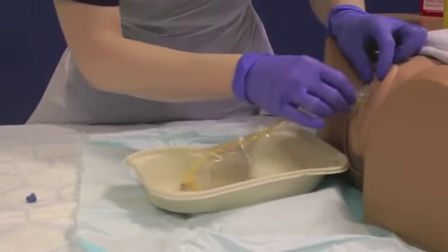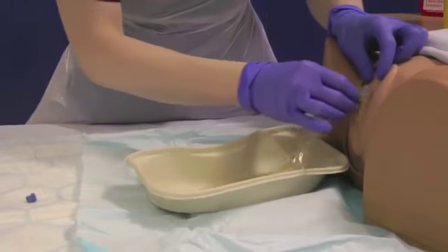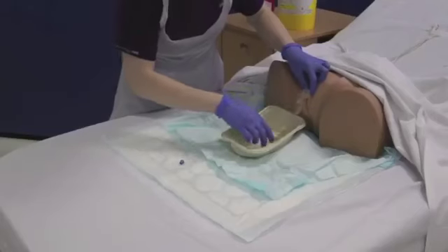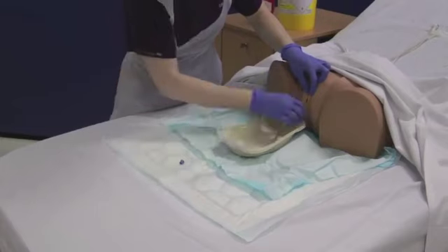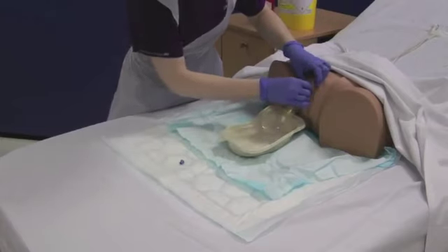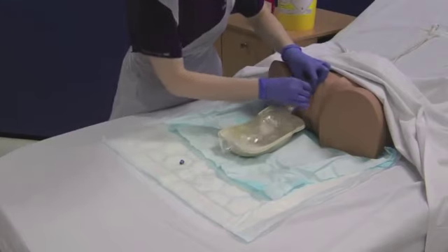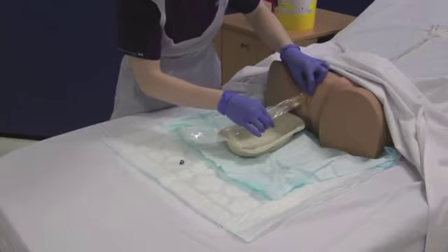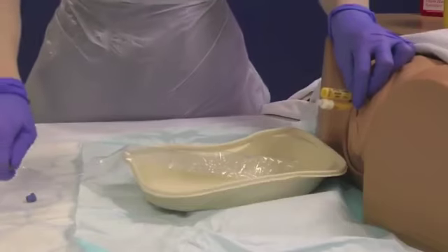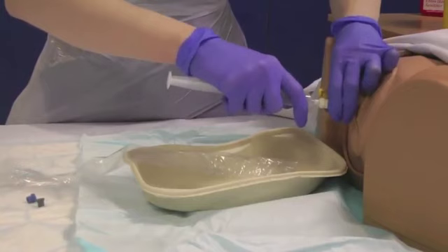Insert the catheter along the urethra into the bladder. If there is any resistance, ask the patient to cough, which may ease insertion. Never force the catheter. Once the urine starts to flow, advance the catheter a further 5 centimeters. Take your 10 ml of sterile water from your sterile field and inflate the balloon, observing the patient for any signs of discomfort.